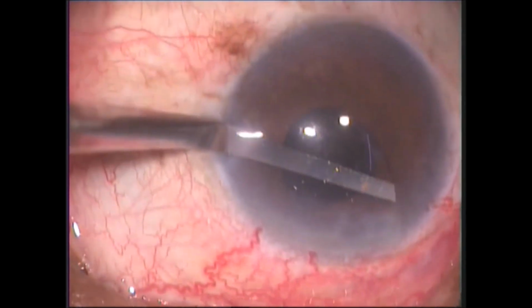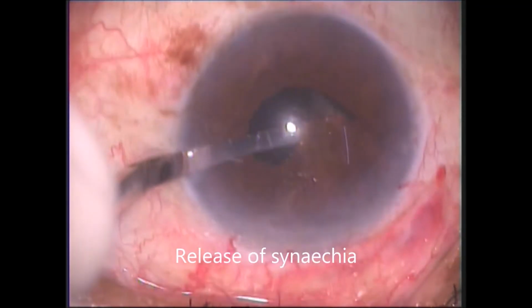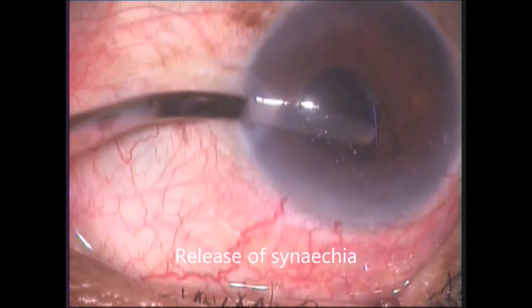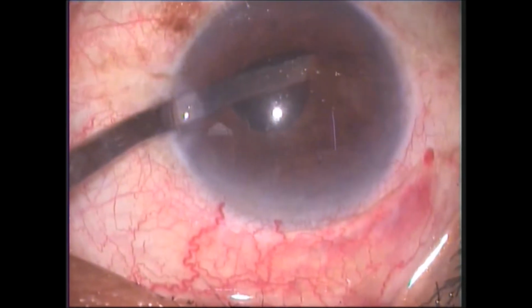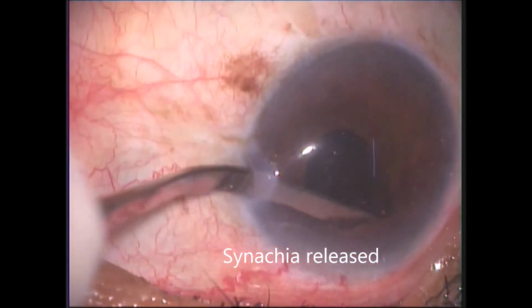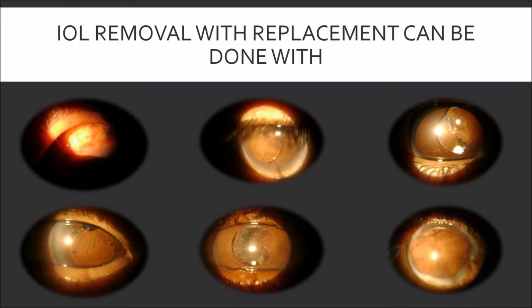Pupillary capture. This can be separated with the help of an iris repositor. While releasing synechia, care is taken not to damage the posterior capsule or iris. With careful releasing, we can get a round circular pupil. But there are certain situations where the existing IOL is not able to be repositioned back into the bag or near the bag. So it needs to be removed and replaced with a new one.